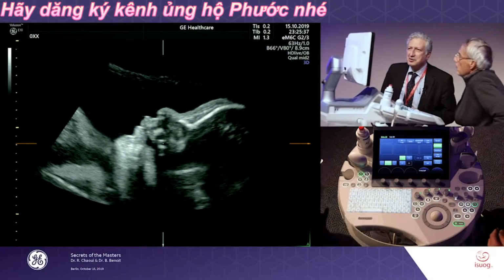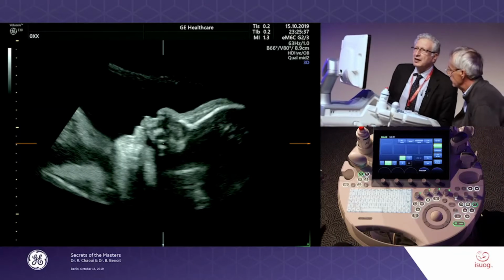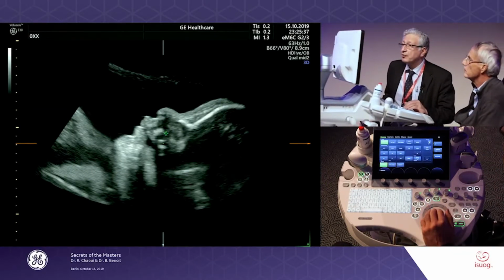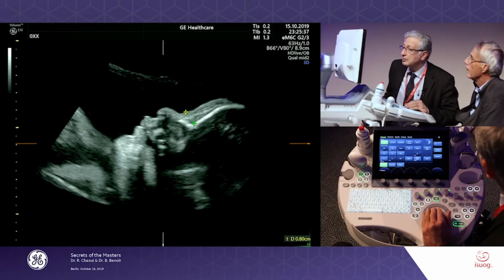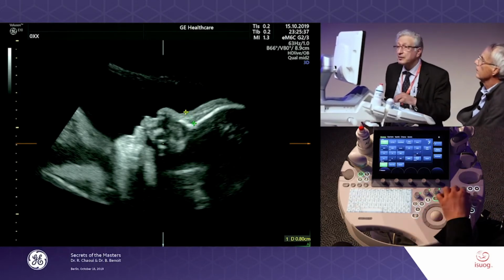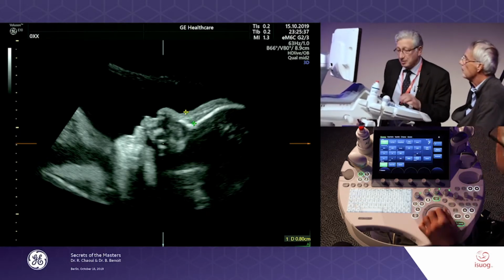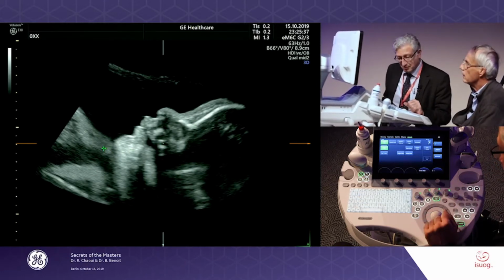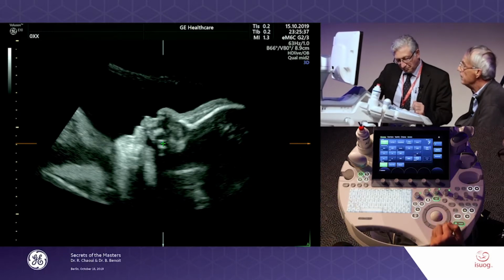This here is, as you see, a fetus with profile, assuming it's a prefrontal edema of 8 millimeters. But is it a prefrontal edema, Bernard, or what do you think? So if you use 3D, you have to check on the multiplanar plane to know if it's exactly the mid-sagittal plane.